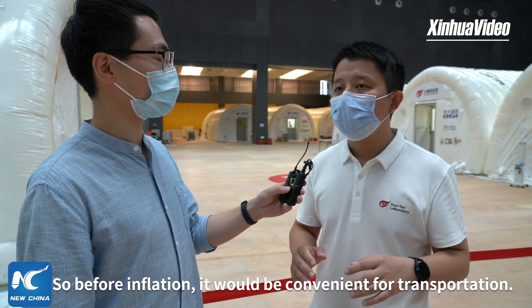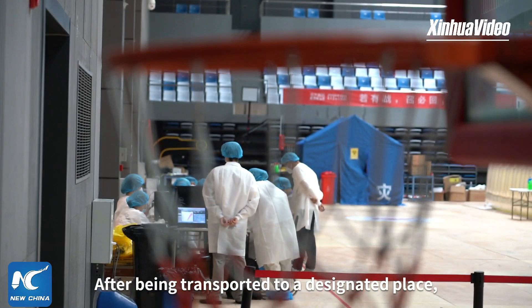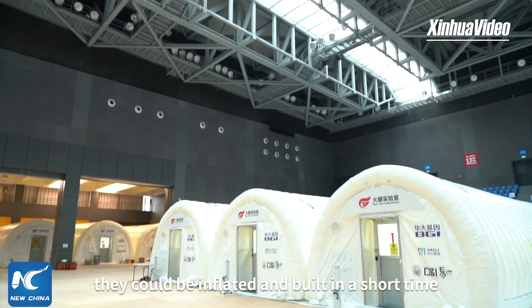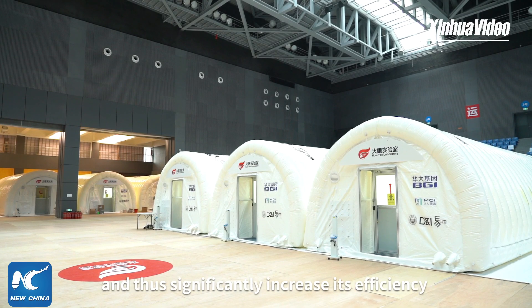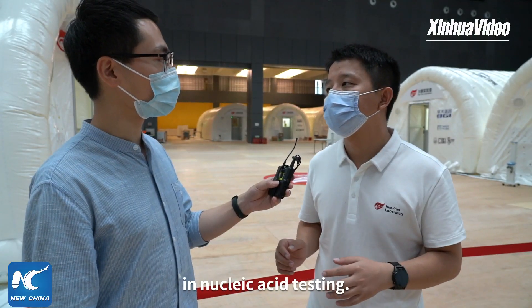这个实验室是通过充气的方式搭建起来的，它在未充气之前它方便运输，运输到指定的地点之后，快速的充气快速的搭建能够满足短时间内的大量的核酸检测需求，所以它能够起到一个更高效的提升核酸检测能力的作用。(This lab is built through inflation. Before inflation, it is easy to transport. After being transported to the designated location, it can be quickly inflated and set up to meet large-scale nucleic acid testing demands in a short time, thus playing a more efficient role in boosting nucleic acid testing capacity.)